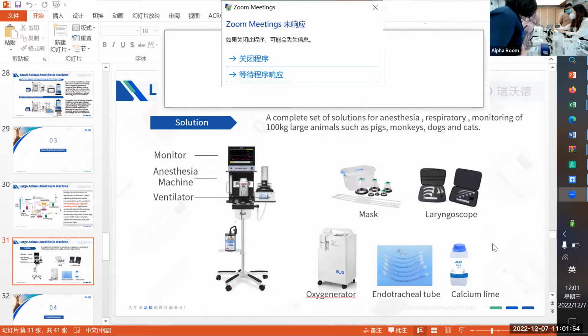I will introduce my one. So this one is the air pump. Yes, you have an in and an out. This in means it can absorb the environment air from the room, so we don't need to connect any pipe. We need to connect the pipe to this out end, and you can see here the oxygen. Yes, you use the pipe to connect this pump out with this end.